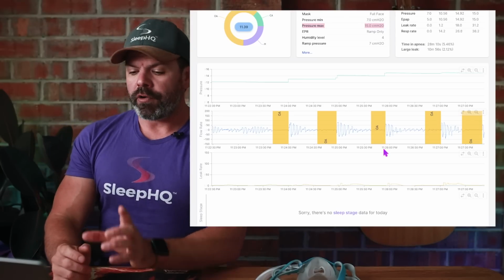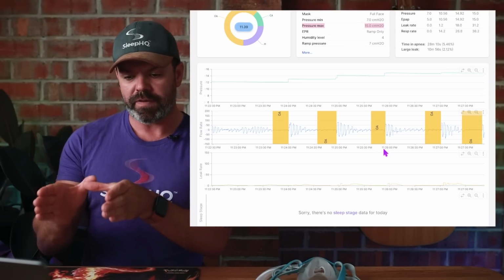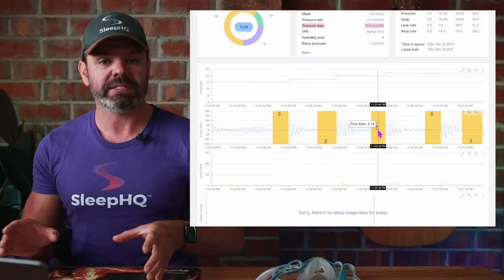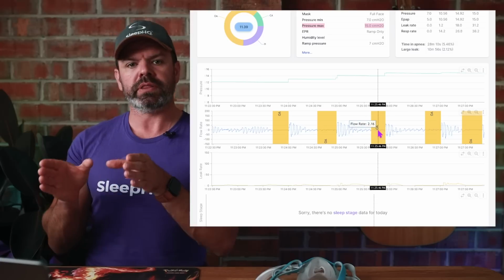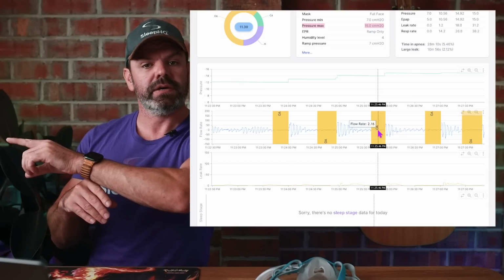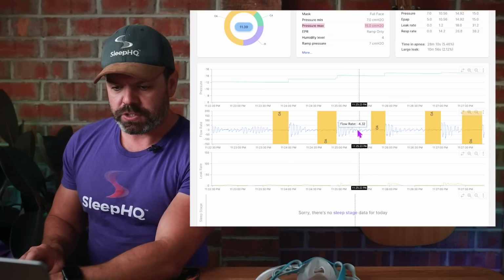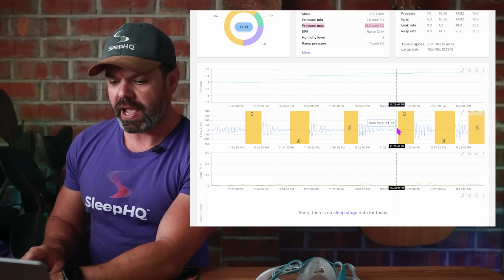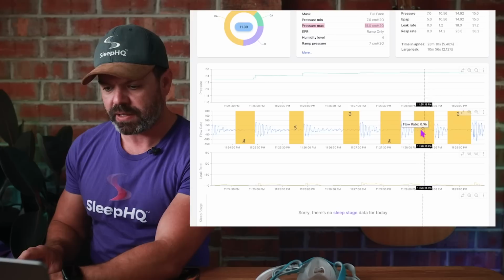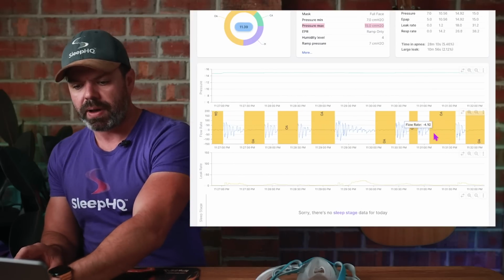Now, what I want to highlight right here is how accurately these obstructive apnea flags, these OA flags here, here, have been marked by the AirSense 10 at this particular point in the night. And then we'll juxtapose that against another point in the night where it's way off. And I'll show you the reason why. So I'll just scroll forward here and you can see that these flags are just perfectly marked where the obstructive apneas are. You see these big flat spots here. These are all obstructive apneas, beautifully marked.